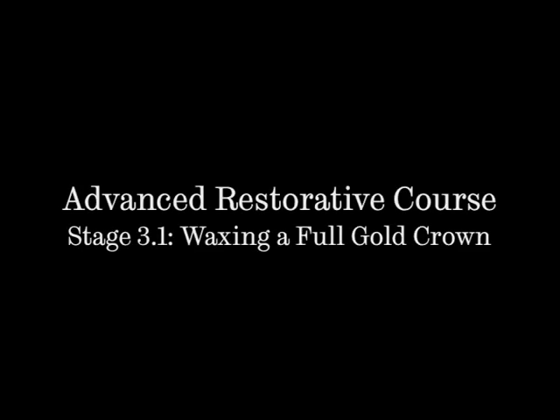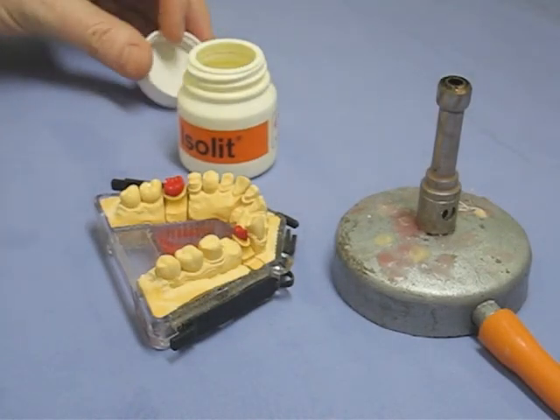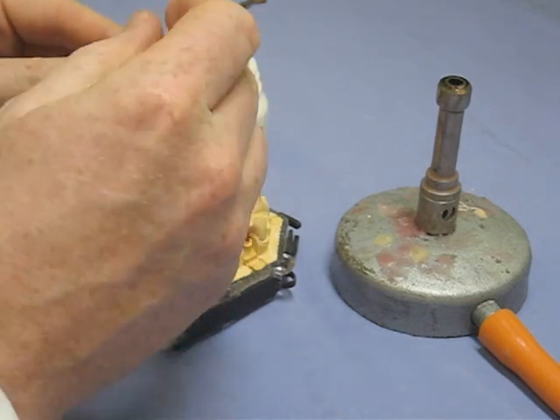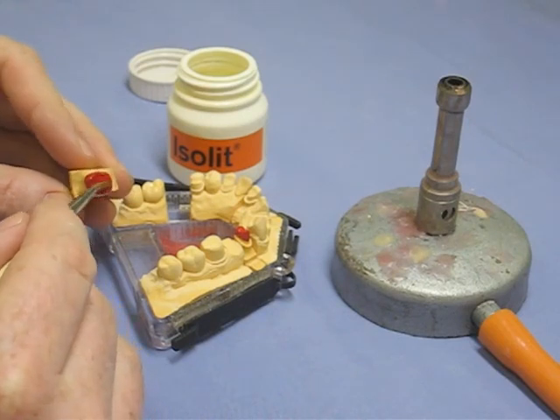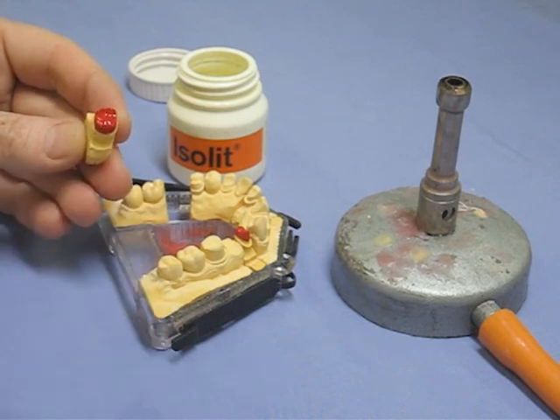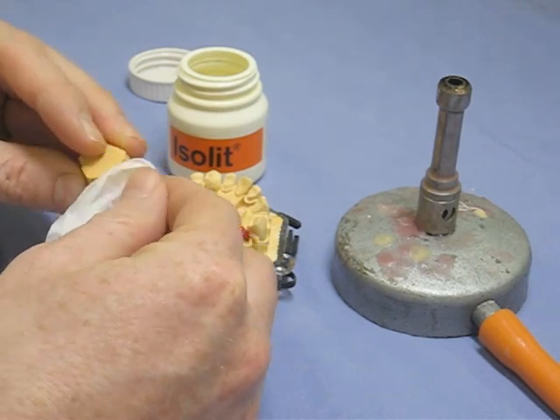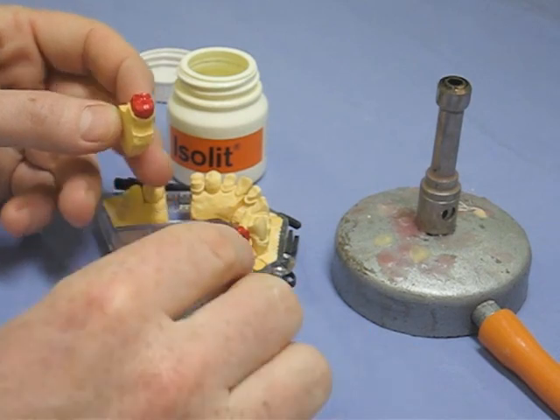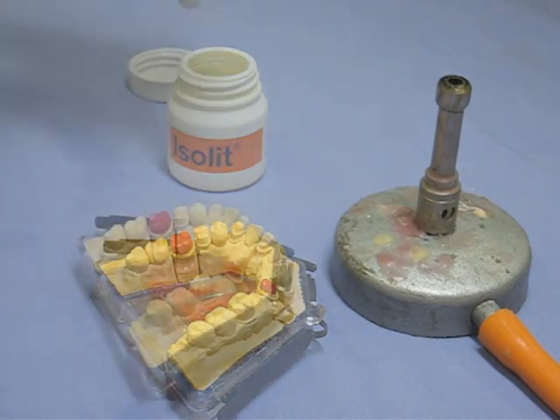This is stage 3.1: waxing a full gold crown. We don't want the wax sticking to the die, so the first thing we do is use some separating solution. This is 'Isolate' — that's just the trade name — and it gets painted all over the die and over the margins. Note that keeping it next to the Bunsen is not a good idea at all, as it's highly flammable. The excess is taken off using a tissue, otherwise it'll make the wax bubble.